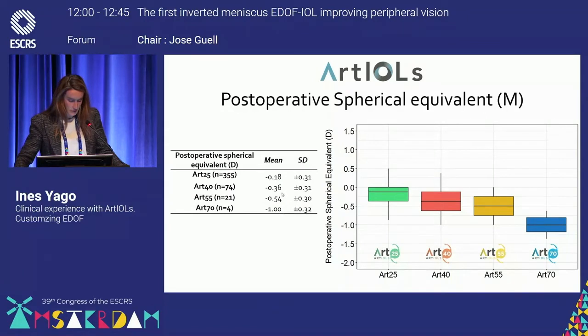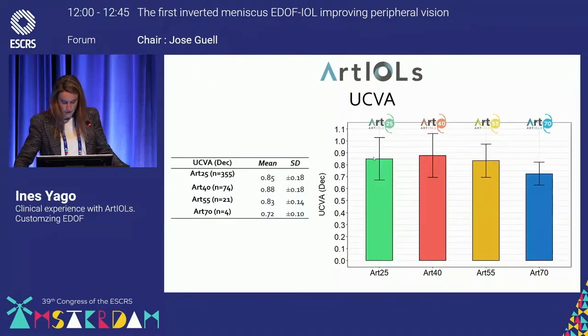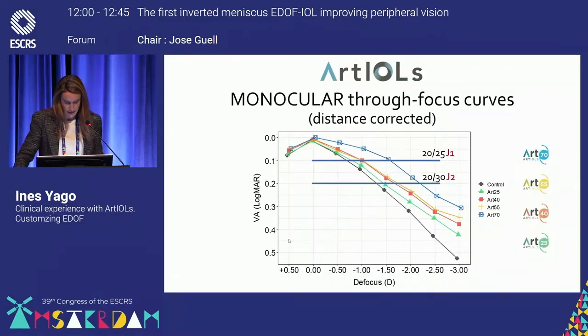As you can see, using the A constant suggested, we are having a slightly myopia in the post-op period. But interestingly, we are having really good results in uncorrected distance visual acuity. This is because this lens is really forgiving with that residual refraction defects after surgery.